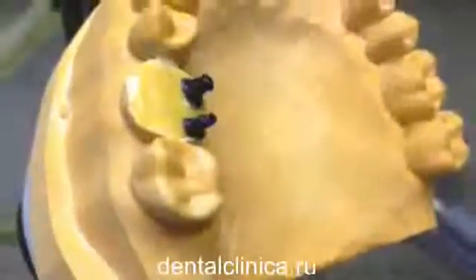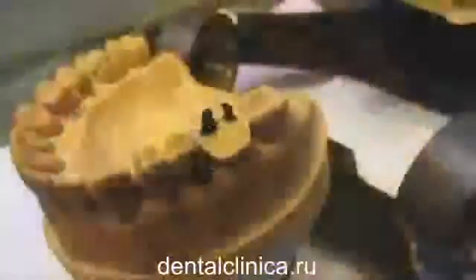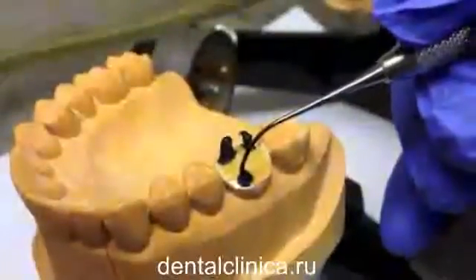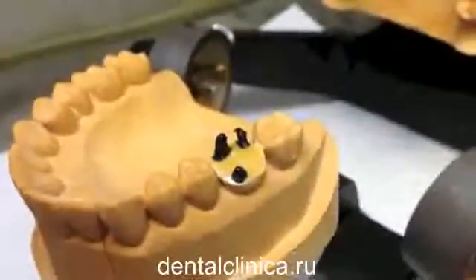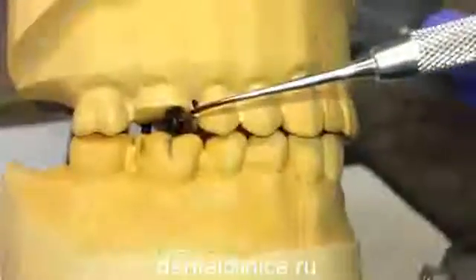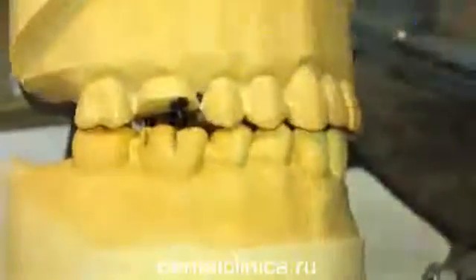Once the supporting cusps or stamp cusps are finished, we can now move on to the non-supporting cusps. We will begin with the mesiobuccal cusp of tooth number 3. The markings made previously will help you align the tips of the buccal cusps where they should be.